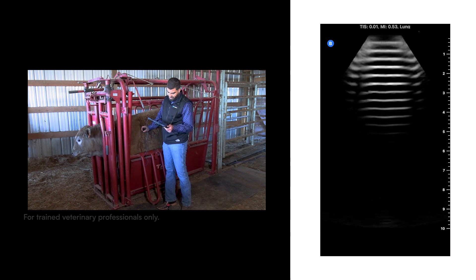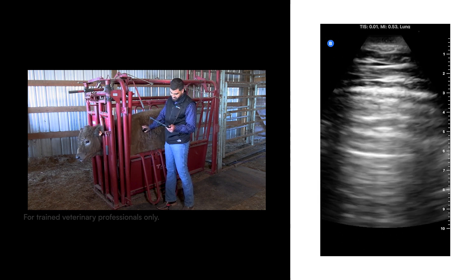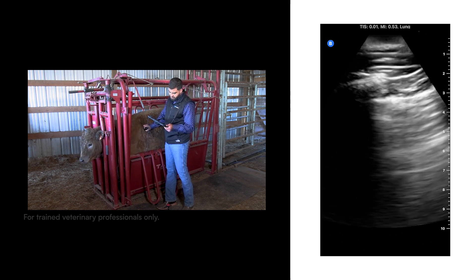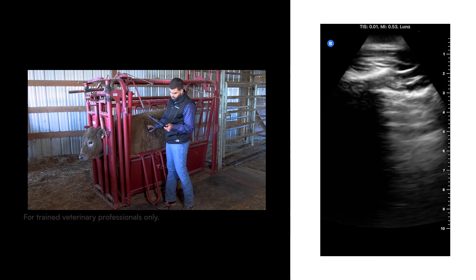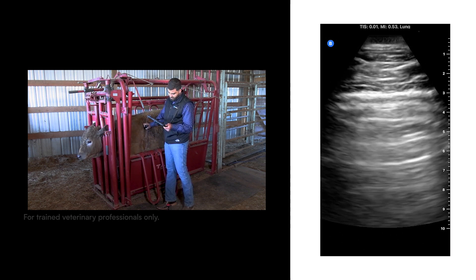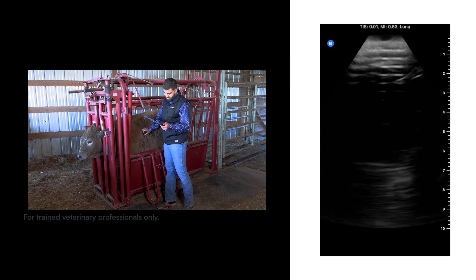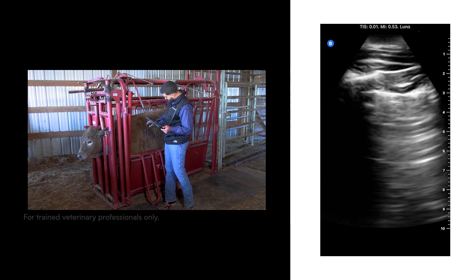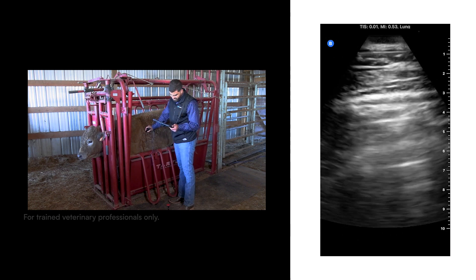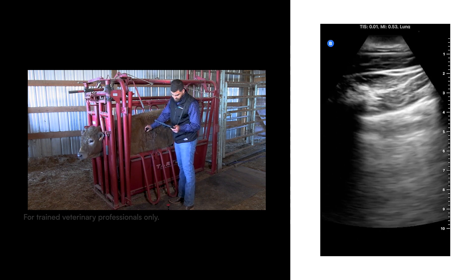In this image, we can see several A lines all the way through, which indicates a healthy piece of lung. There are some incomplete B lines, also called I lines — you can see on the top of the image some little beams that go down, but they are not complete B lines. These lungs look all right. There are a few B lines visible, but they are very thin and very few, so that's not concerning.